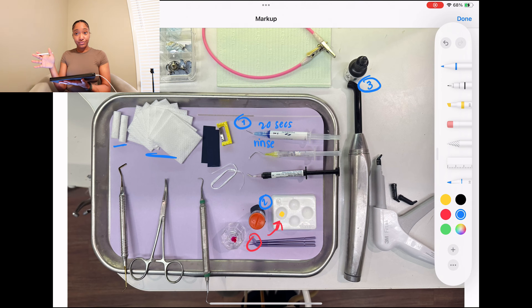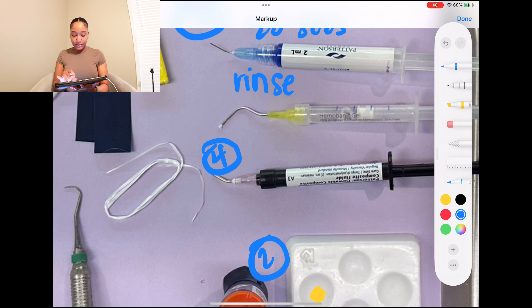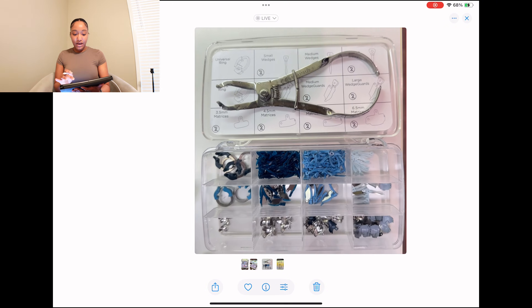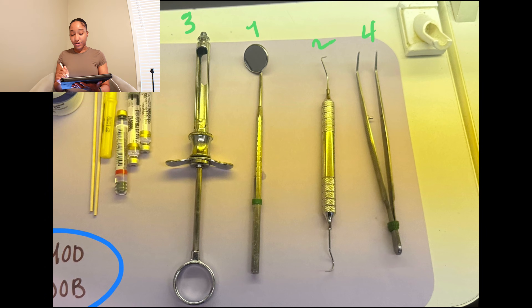You're going to get your curing light and cure that area. Personally, when I'm holding the curing light, I already have my flowable in hand to give to my doctor, so as soon as I'm done curing, he or she can go in with the flowable — that's usually the next step. So step four after curing is the flowable. After my doctor places flowable, she likes to go in and use her explorer to kind of move the flowable around, though some doctors just use the tip of the flowable itself to move it around.